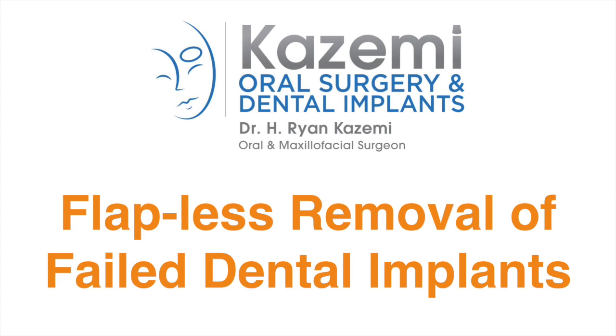Hi, this is Dr. Ryan Kazumi. In this video I'm going to present a unique technique for removal of failed dental implants with no surgical incision or flap.